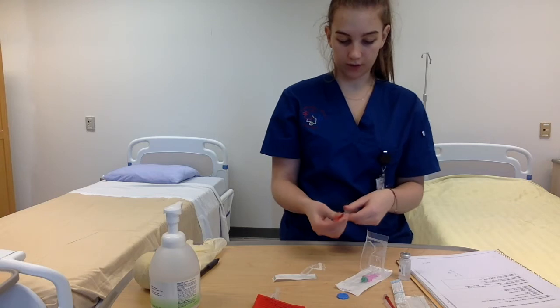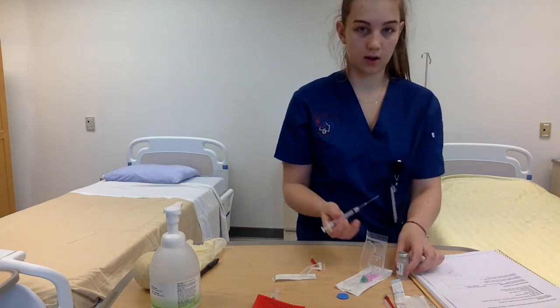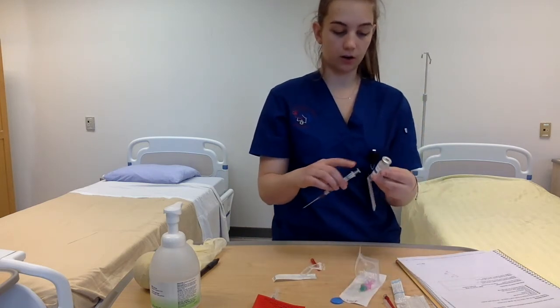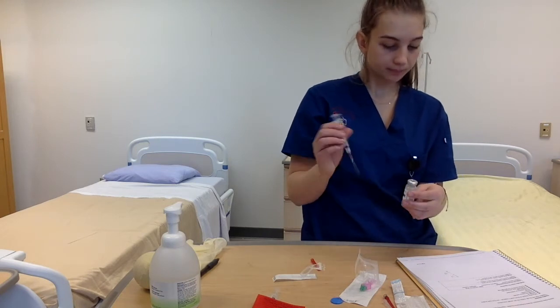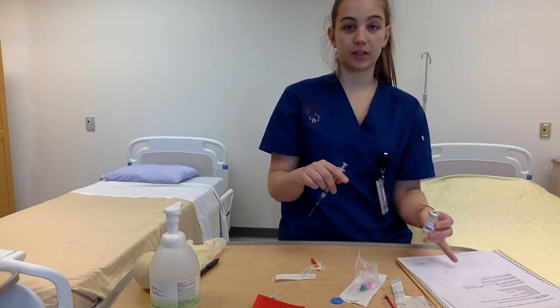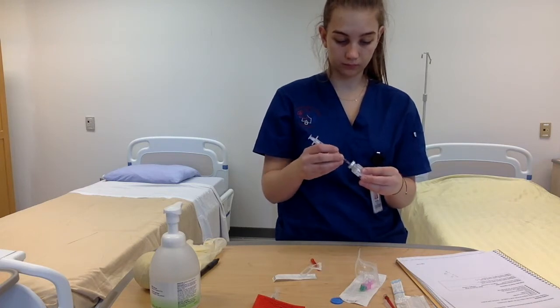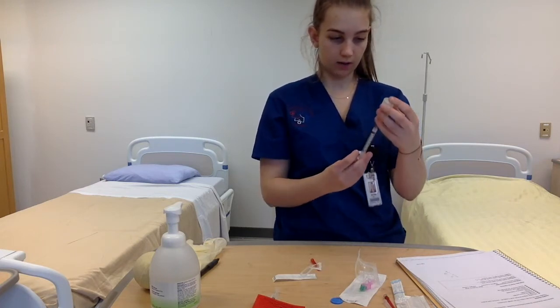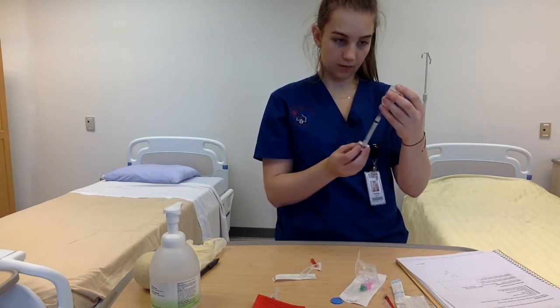And carefully remove the cap. And I'm going to make sure that this is the correct medication. So this medication is Haldol, and that's what it says on the MAR as well. Okay, and we're going to draw up 0.5 milliliters.